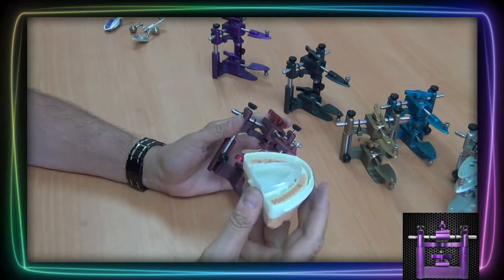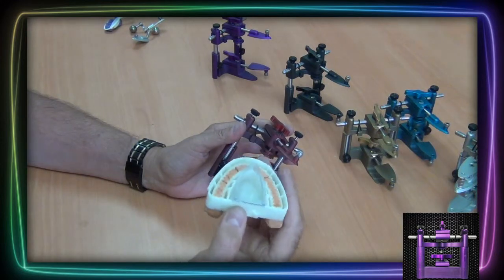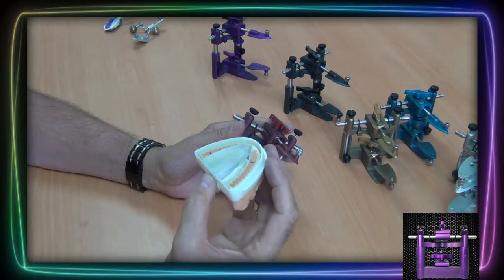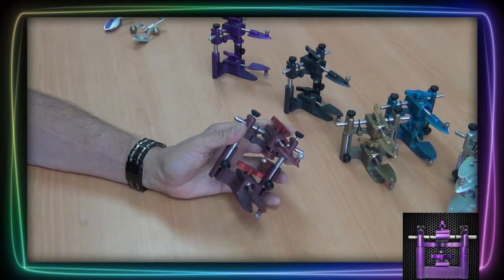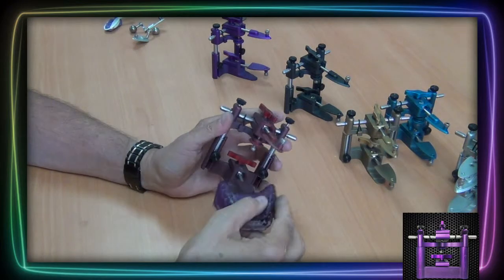Here we have another model system like many others that works very well with our plastic disposable. Here we have a printed model — look at how easy this just slides right into place.